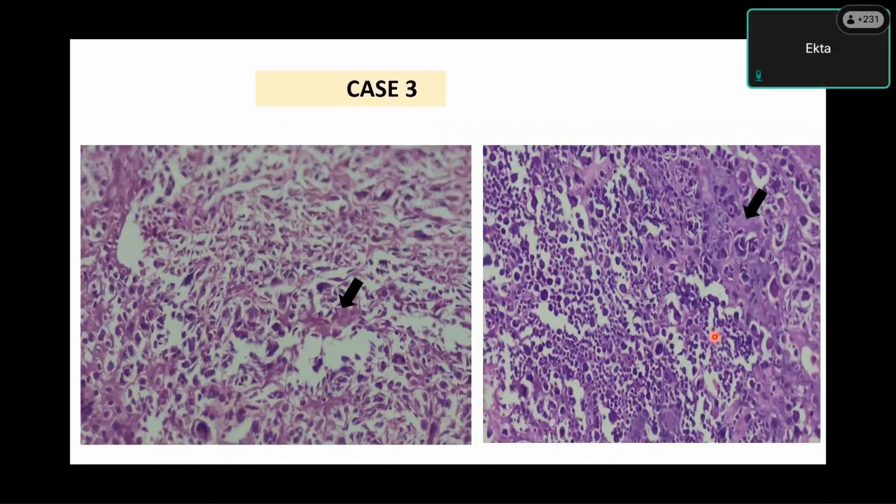There is no desmoplastic reaction. Dr. Bigre, any idea? What are we seeing here? Anybody? Okay, in this picture, see, this is pink colored material here. Somebody has written heterologous elements. Yes, Dr. Gunjan, very good.